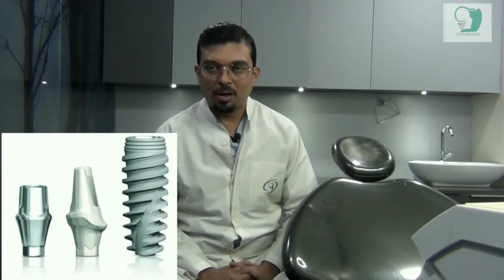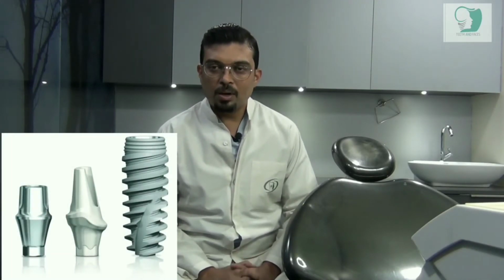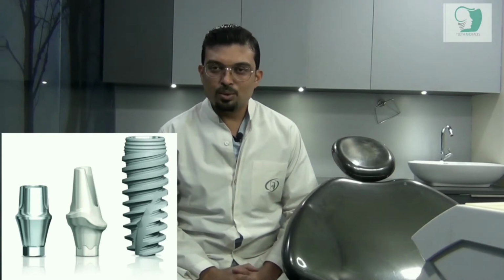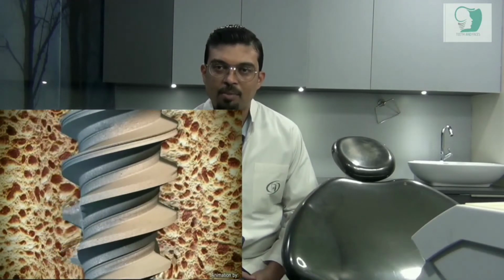What is a dental implant? A dental implant is a modern surgical tool which is used to replace missing teeth. It is a cylinder-like structure, most commonly made up of titanium. It has threads, and the threads have micro porosities or micro irregularities on top of them.